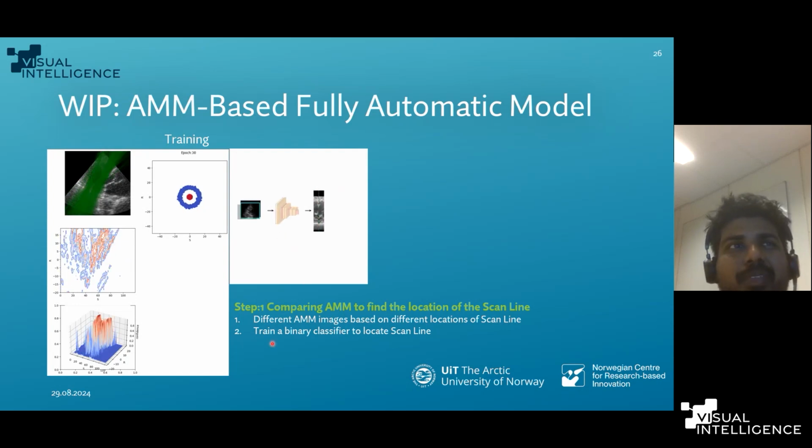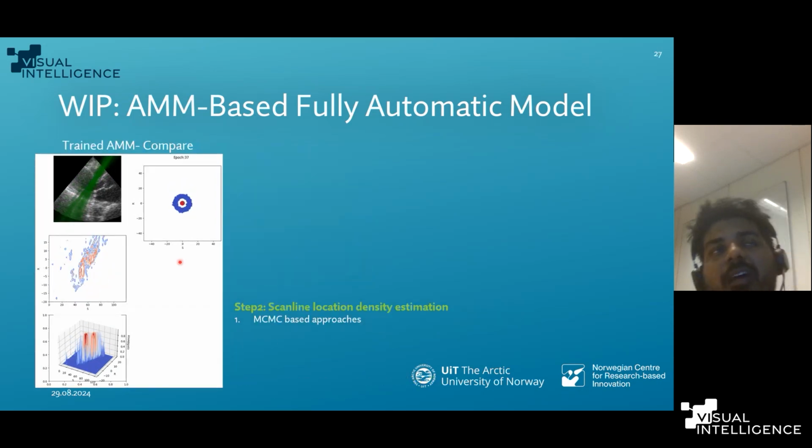So this is how the model predicts. Based on this density-based analysis, the model thinks these are the probable locations where it has high confidence for the AMM image to be the correct AMM image, what the model has seen as part of the positive class during training.